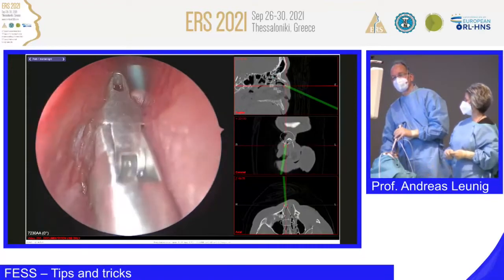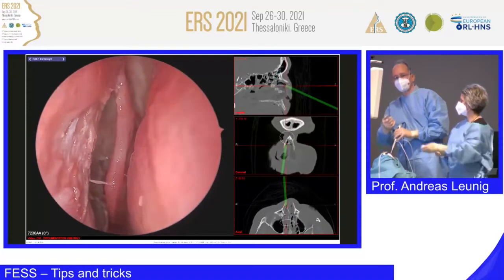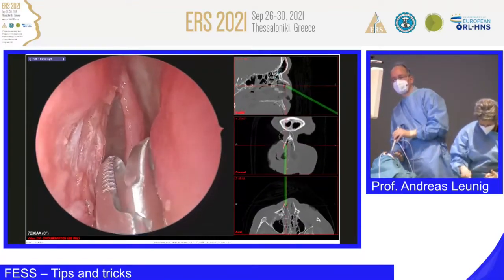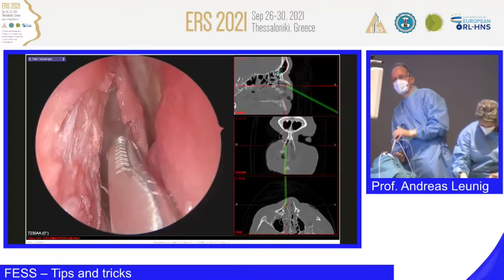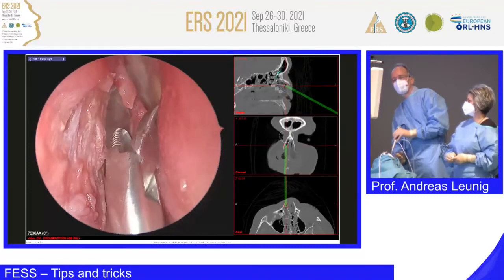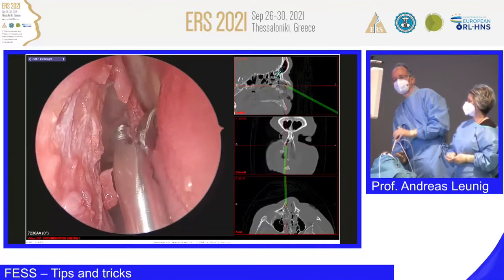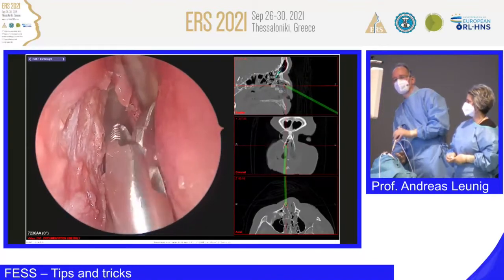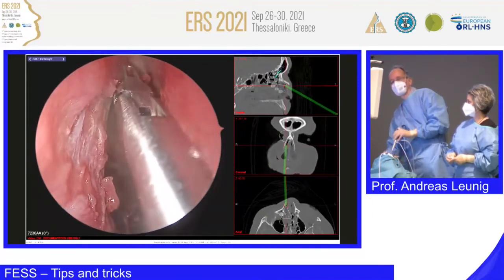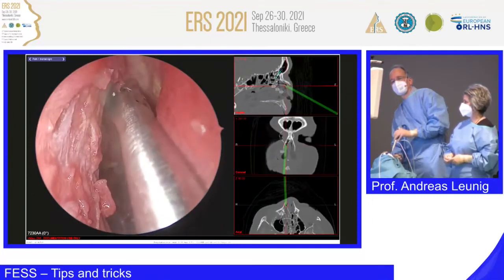So I take this flap away just to show you a bit better. It's like this. Now the next step is I resect a part of the axilla of the middle turbinate. And how much? That's the question. I do it until I reach the level of the posterior wall of the frontal recess. Like this, check.